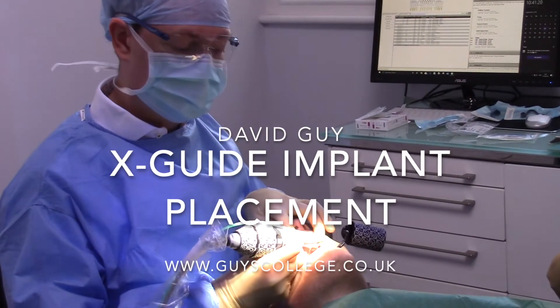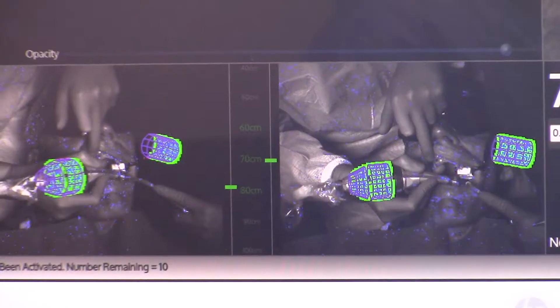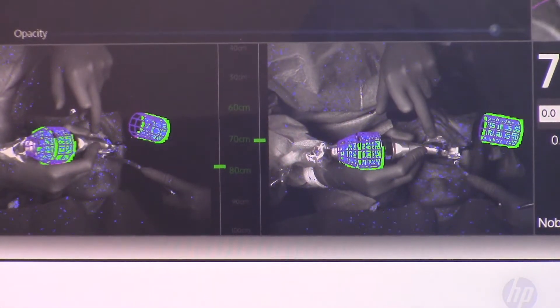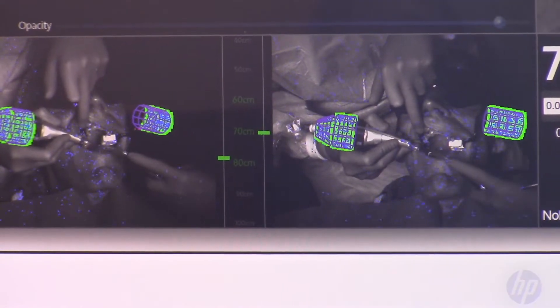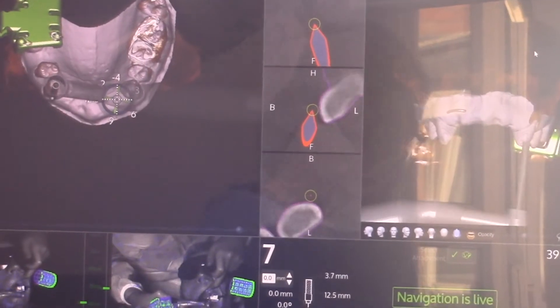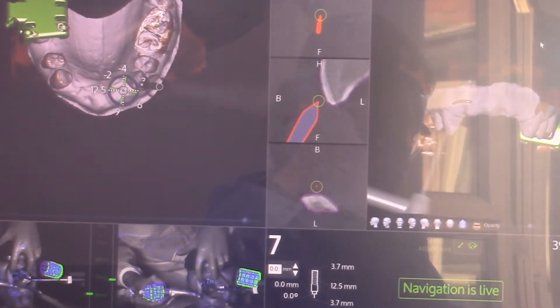Today I'm placing an implant using the X-Guide system, which is distributed by Nobel Biocare. Two cameras tracking my movements in real time are giving me feedback superimposed onto the CT scan. As I move my handpiece from tooth to tooth, the screen is showing me the same movements.